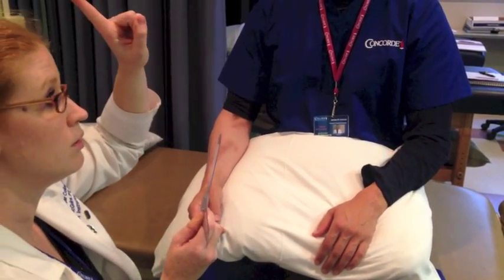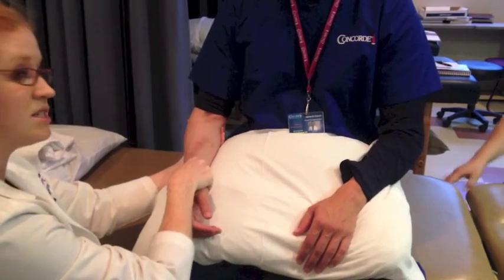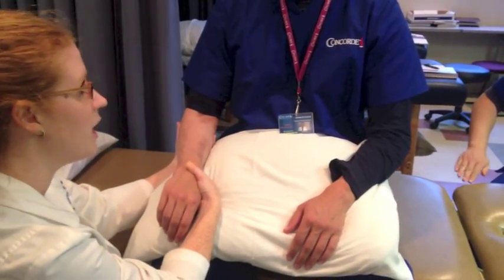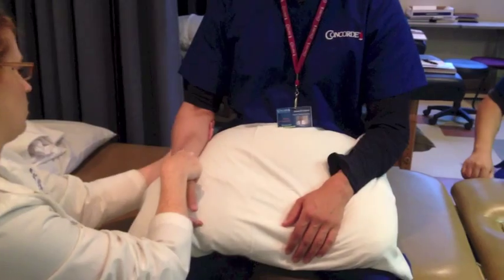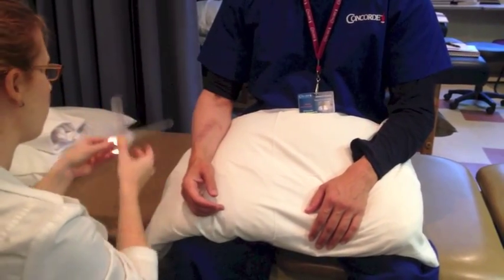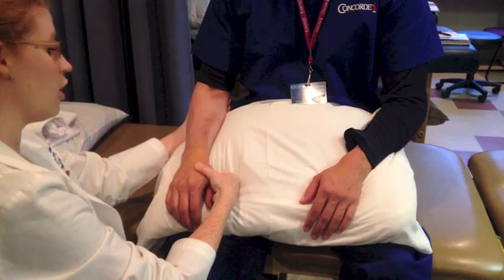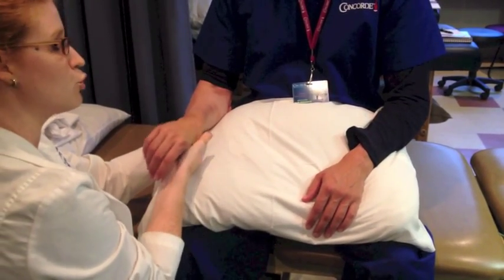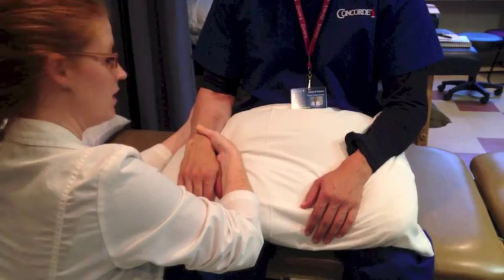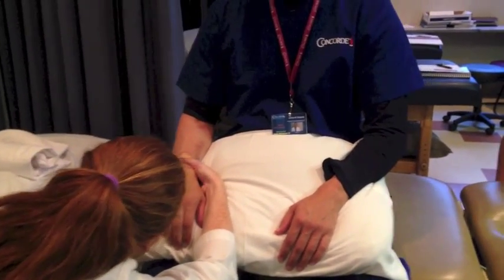Keep the stationary arm pointed straight up. I'm pronating him — so this is zero, and then I get to here. I'd say that's just about 90, maybe a little bit more. I'm going to preset my goniometer — this is our zero, so we move it to 90. I'm going to stabilize here, fully pronate him, making sure I'm not crossing the joint. If I'm moving him from the hand, then I'm moving his wrist and thumb. I'll hold right here, keep it at the ulnar styloid, parallel to the dorsum of his hand.